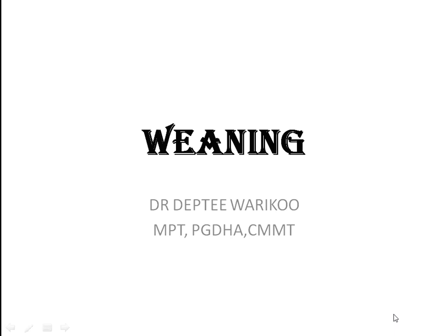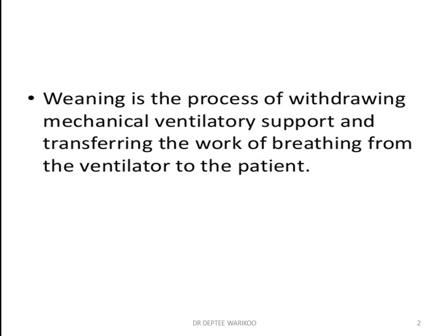Weaning from the ventilators. So we'll start off with what is weaning. Weaning is the process of withdrawing the patient from the mechanical ventilator support and transferring the work of breathing from the ventilator to the patient. Weaning is the disconnection from the ventilator.